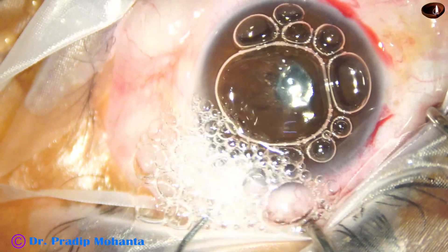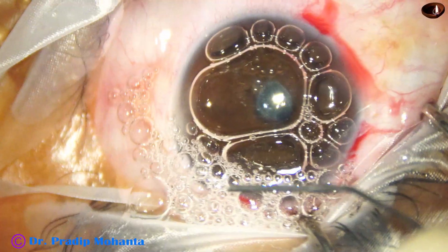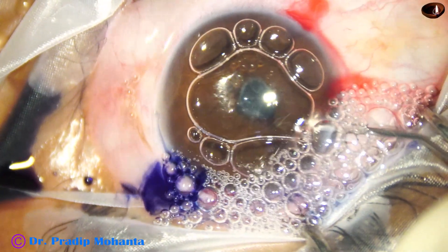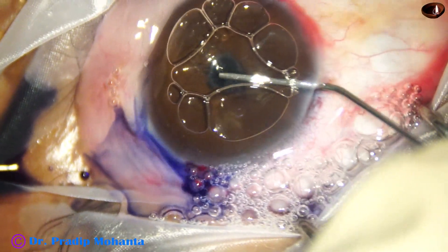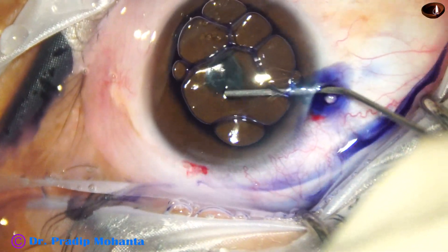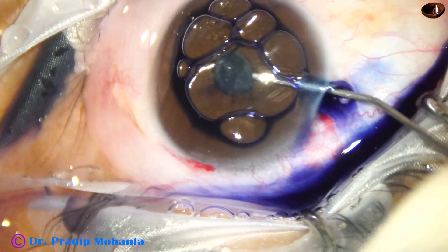Now my plan is to stain the capsule. To stain the capsule I have to go behind the iris, if I can find some entry through this membrane somewhere. But I cannot find any entry behind the iris — the membrane is covering the pupil and there is no gap.